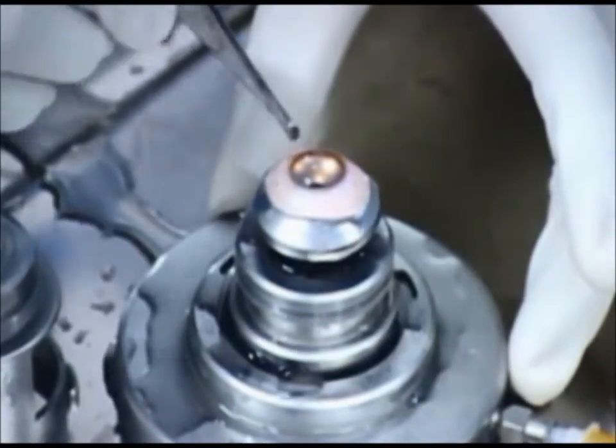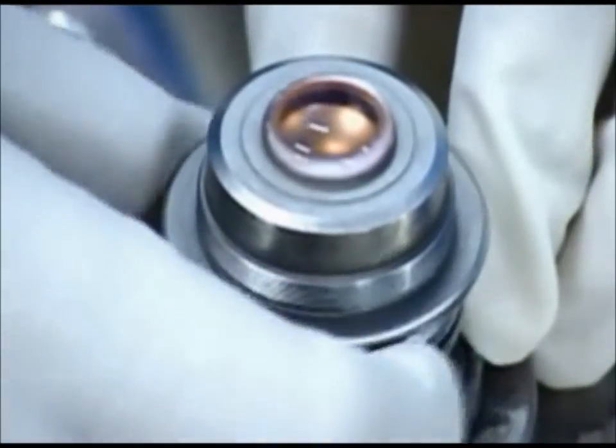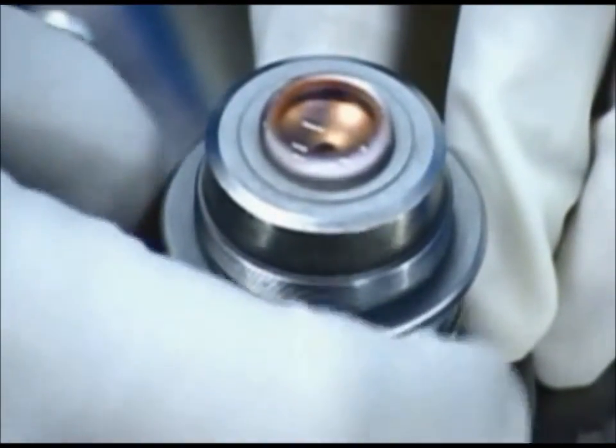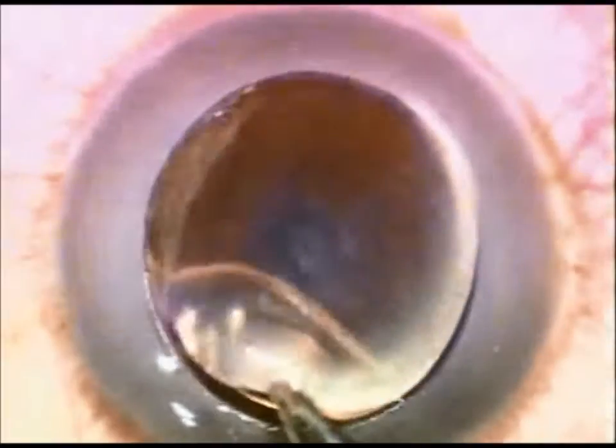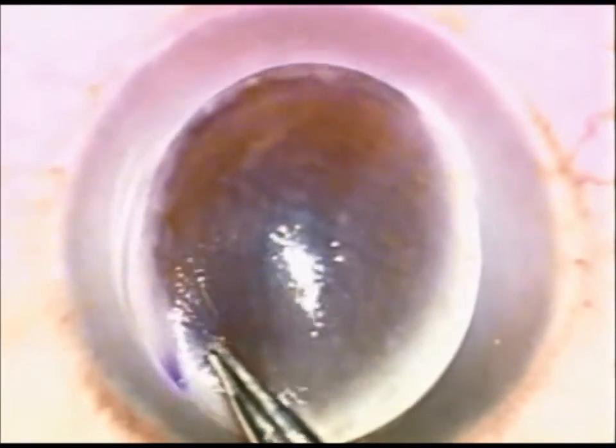A century has passed since the first corneal transplant was performed in 1905. Ever since, surgeons have been innovating to make the procedure more predictable, reliable, and easier to perform. One of the major issues with corneal transplantation has been good wound opposition.